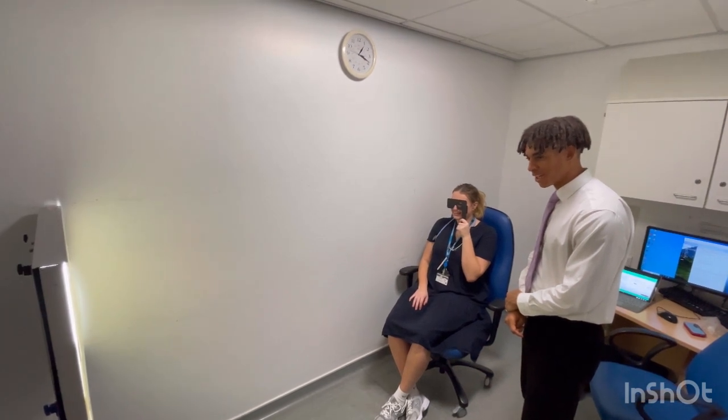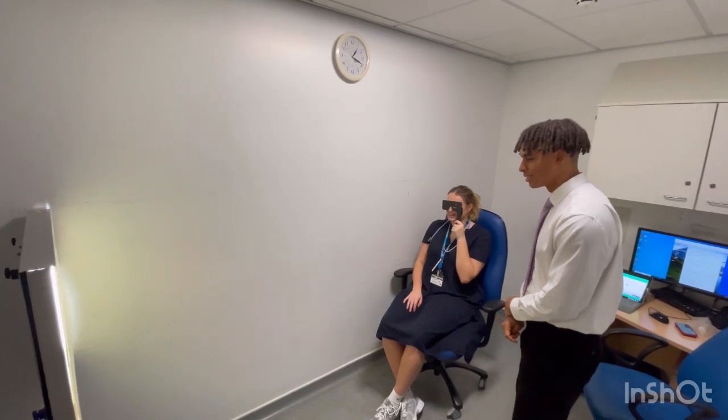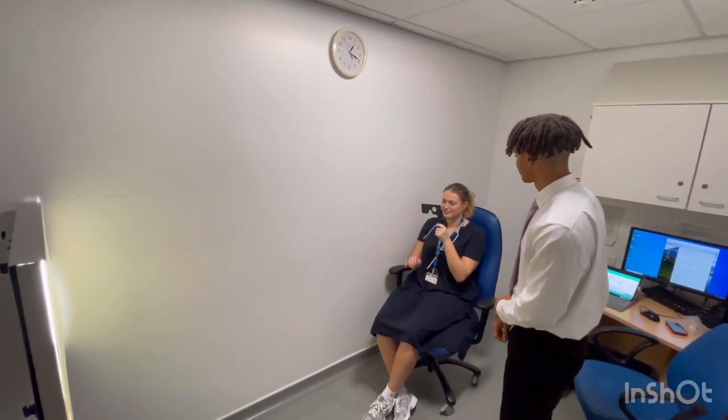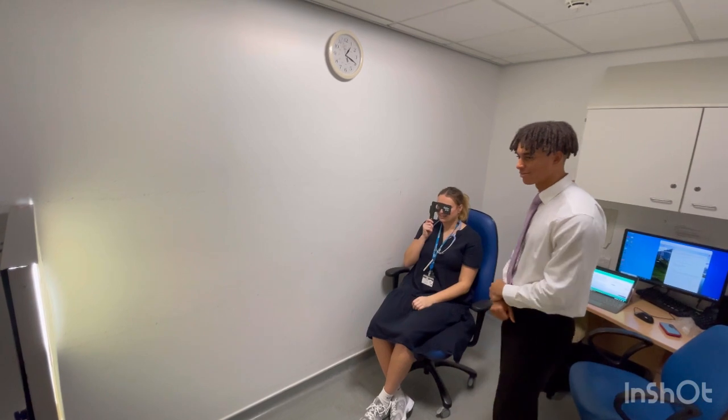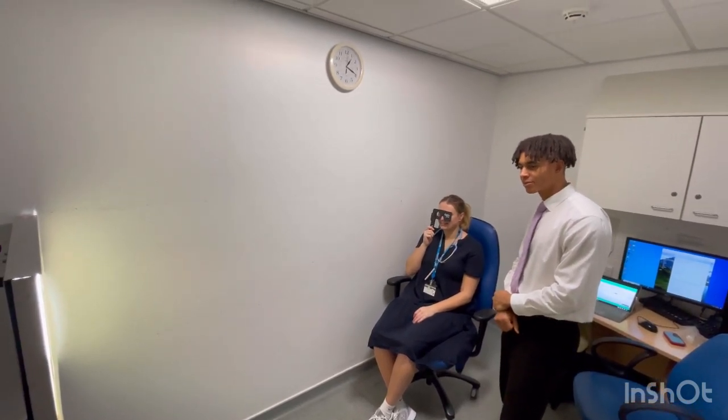So after you've done the first section, change to the other eye. At this point, if the patient uses distance glasses, put these on and repeat. So you do one eye, cover, and then you can use distance glasses after that.